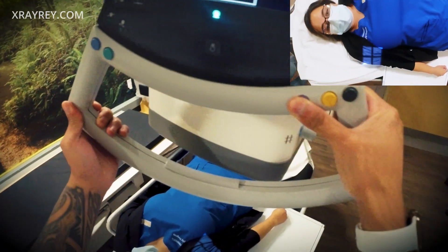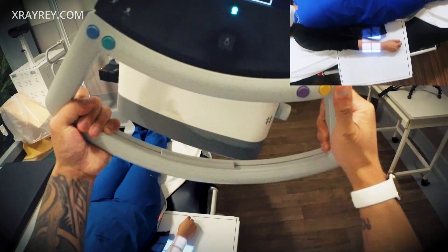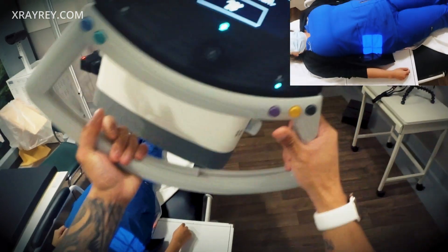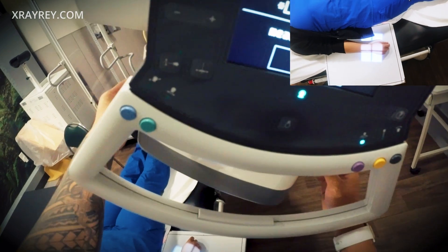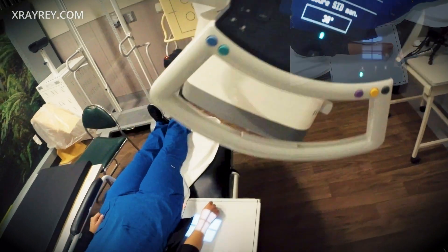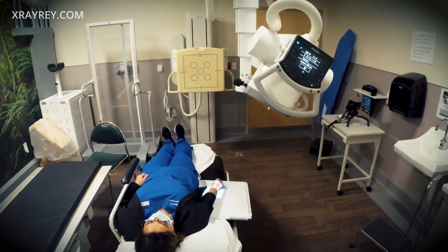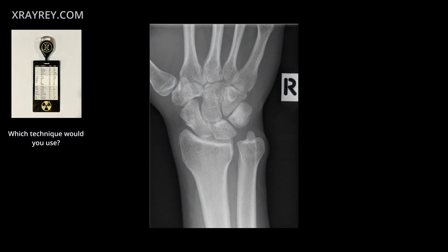That's okay, we're just gonna move around you here. Thank you. No problem. All right, hold very still.